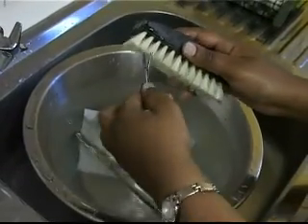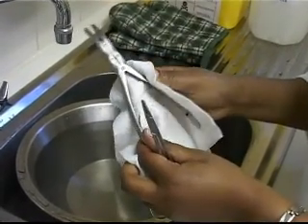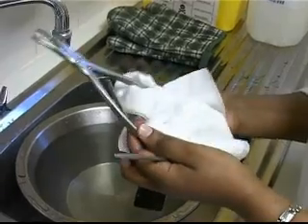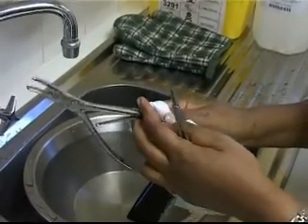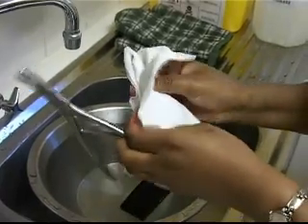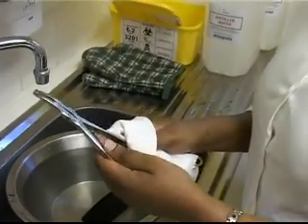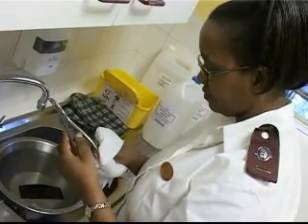Thoroughly clean, rinse and dry items before loading them into the sterilizer. Ensure that the cleaning agent used is a chloride-free product. Certain cleaning agents are highly corrosive and should be avoided. Instruments must be well-rinsed to remove all chemical residues and then well-dried prior to sterilization. Check the instruments for signs of damage.